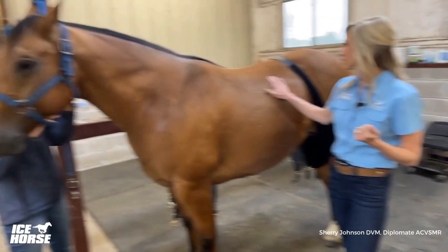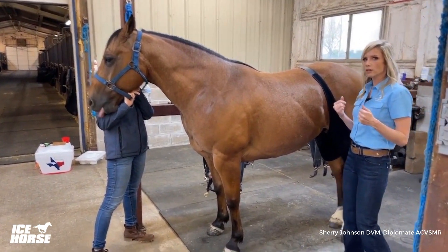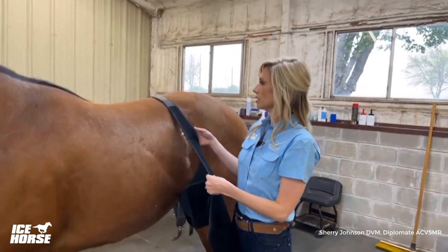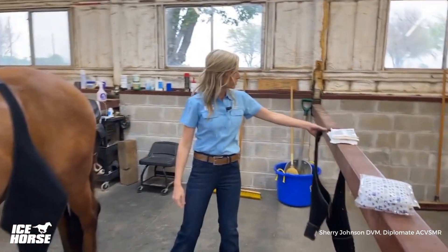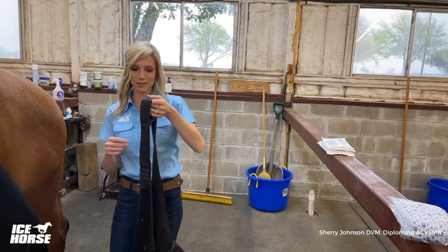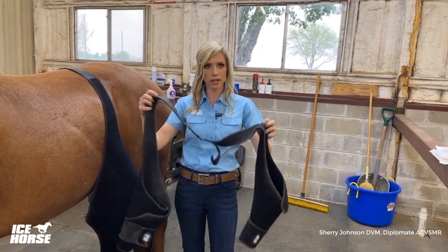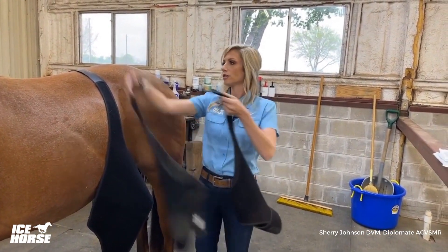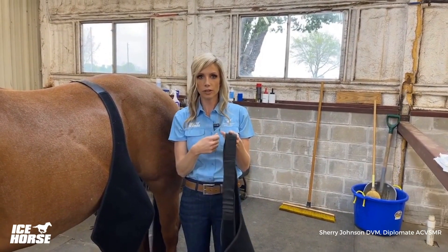We have our horse here, and I actually have the ice wraps already applied, but I'm going to show you how I would normally put these on start to finish. The first thing noteworthy is that I keep the wraps connected between uses — you can see this is our in-the-barn pair, which looks more used than our nice new set. I keep them connected like a set of trousers, and each wrap is labeled left hind or right hind. When you're in the barn for everyday use, you can simply throw them over and get started without unvelcroing and re-velcroing.